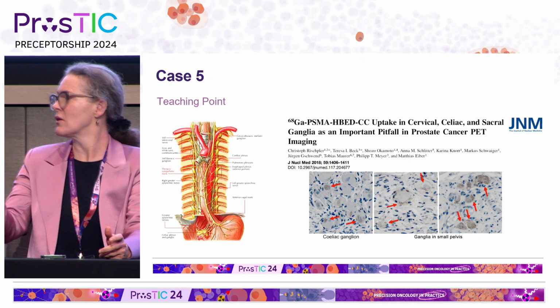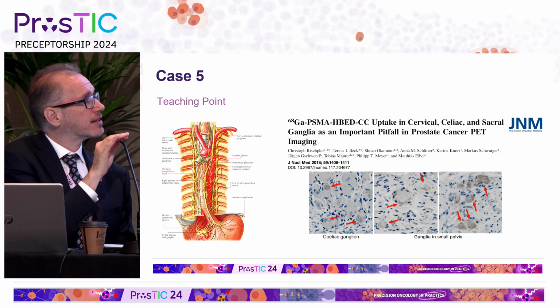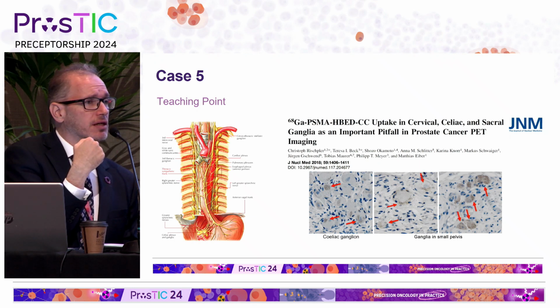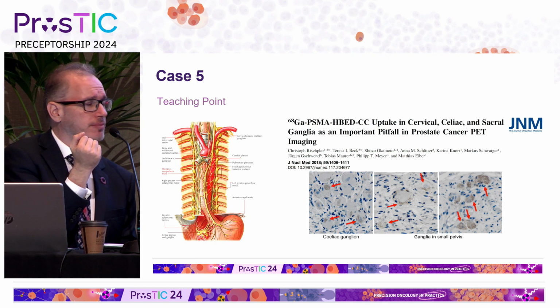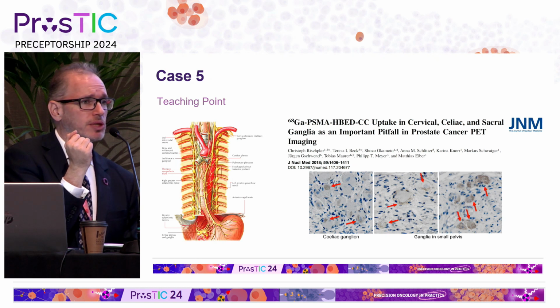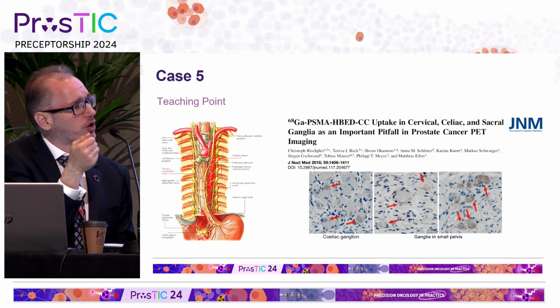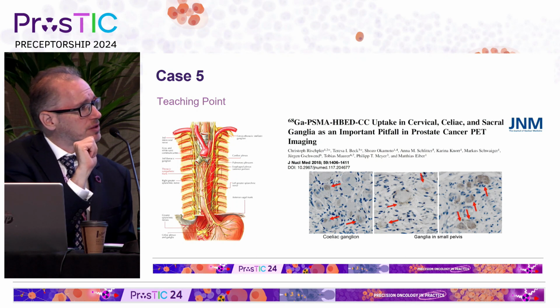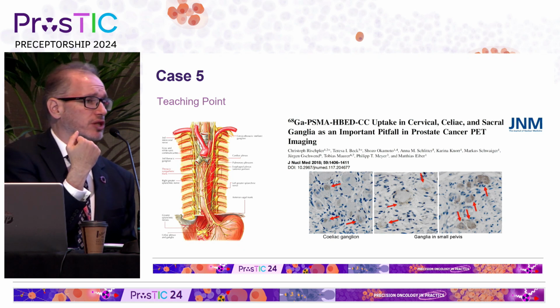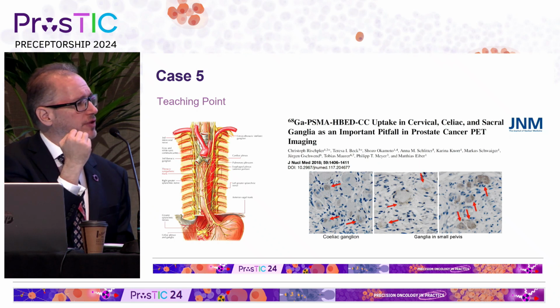So this was a trap early on in PSMA PET. This is actually uptake in the celiac ganglion. And when PSMA PET got introduced a decade ago, I think these were called lymph node metastases, quite confidently. Then some colleagues in Germany did an excisional nodal dissection with a probe where you could find the nodes very carefully, and they cut the celiac ganglion out and confirmed PSMA expression. And we see the same phenomenon in the stellate ganglion. So this is an unusual phenomenon.